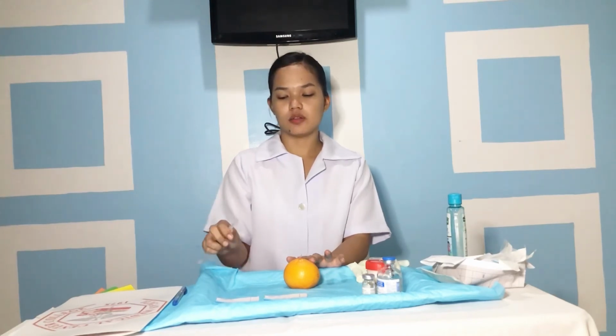So now we're going to administer the intramuscular injection. So for this, we position the ulnar aspect of our non-dominant hand just below the site, and pull approximately 1 to 1.5 inches down or laterally to administer in a Z-track. So we hold this position until the medication is injected. Then we inject the needle quickly at a 90-degree angle into the muscle.